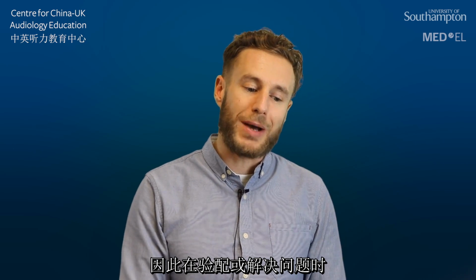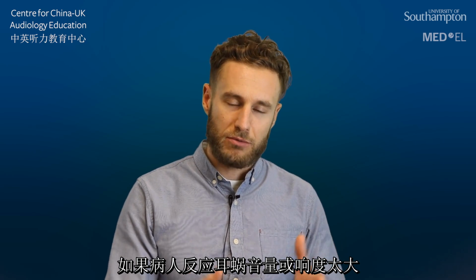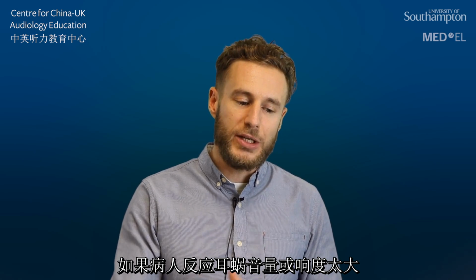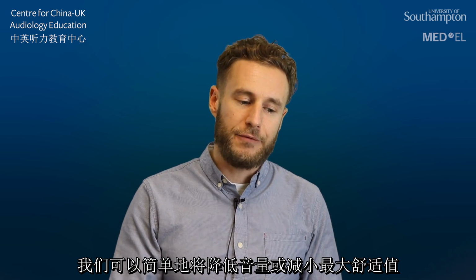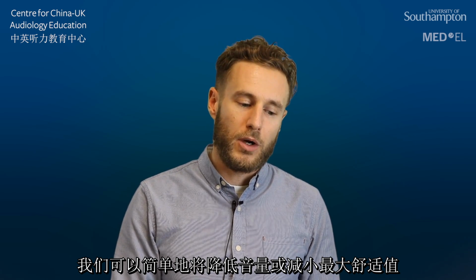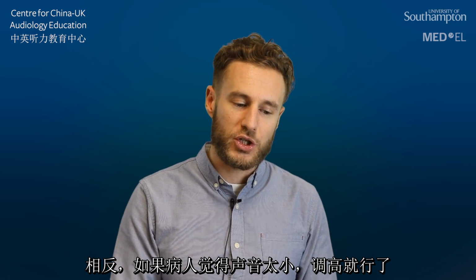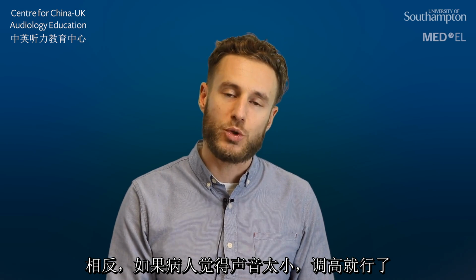When we talk about troubleshooting and fitting, for sure it's a rather simple and easy task to reduce the volume or all the MCLs globally if the CI user reports that the loudness is too strong. Vice versa, we can just increase volume or MCLs when the map is too soft.